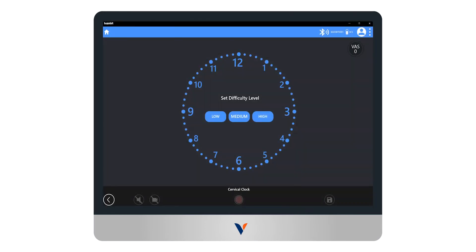Select the difficulty level for performing the test. Select the targets for the exercise by clicking on the corresponding number in the central ring. Finally, select the duration of the exercise and the number of repetitions for the patient to complete.